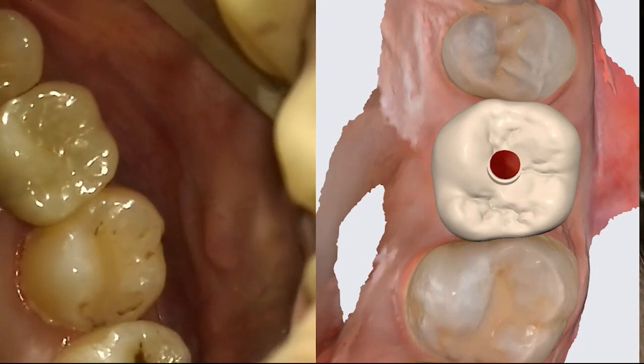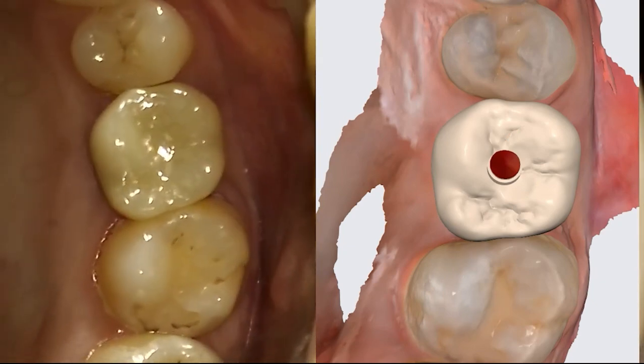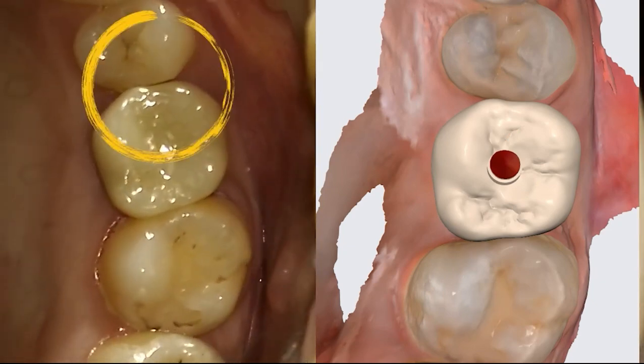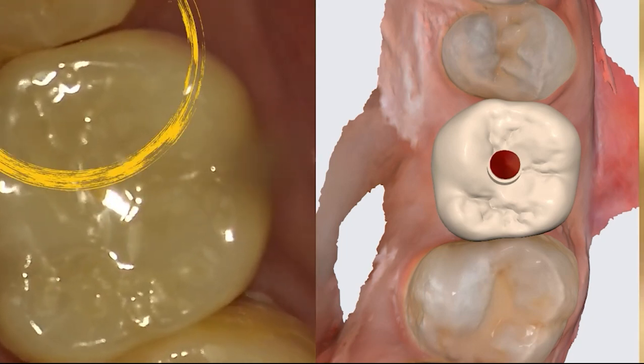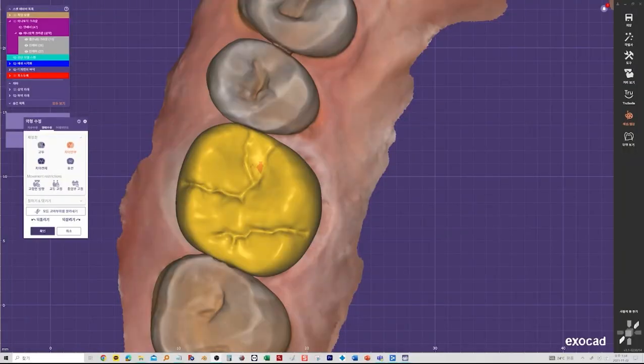This is a video of a patient who came in a year later with food stuck in her teeth. As a result, his mesial-adjacent space has become open. When preparing a tooth, you need to make sure that the adjacent surfaces of the neighboring teeth are even. If this is not the case when designing the crown, it should be reflected in the design and compensated by trimming the neighboring teeth at the time of setting.